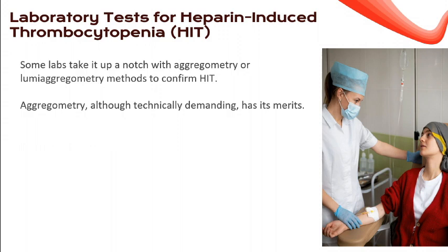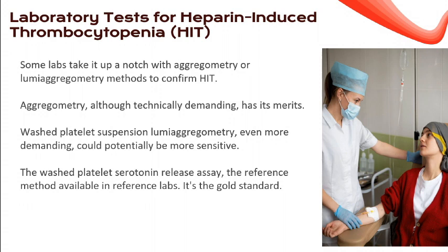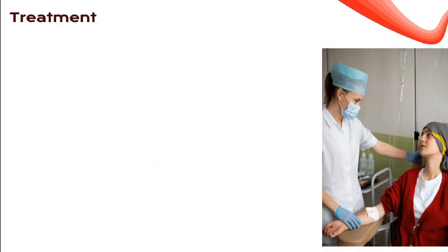Aggregometry, although technically demanding, has its merits. Washed platelet suspension lumiaggregometry, even more demanding, could potentially be more sensitive. But wait, there's more, the washed platelet serotonin release assay, the reference method available in reference labs. It's the gold standard. Now that we've cracked the lab code, let's talk treatment strategies.